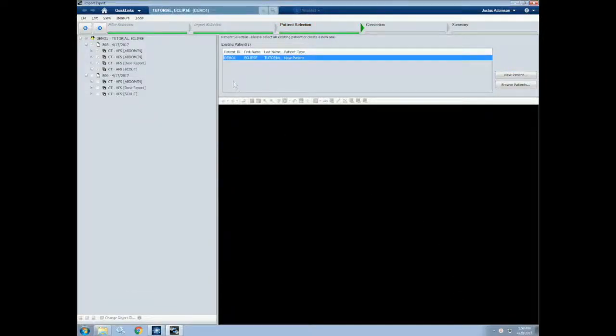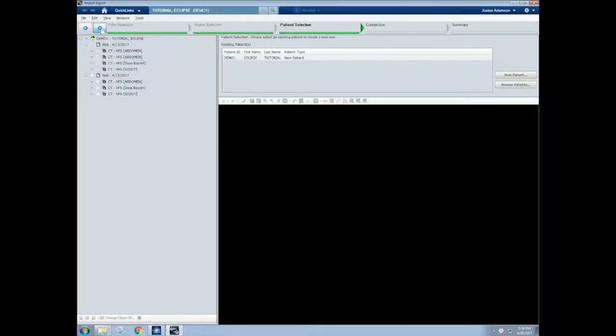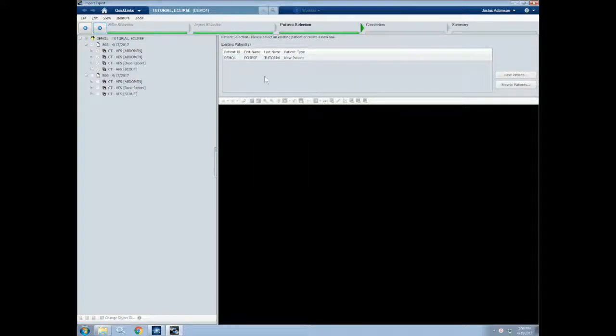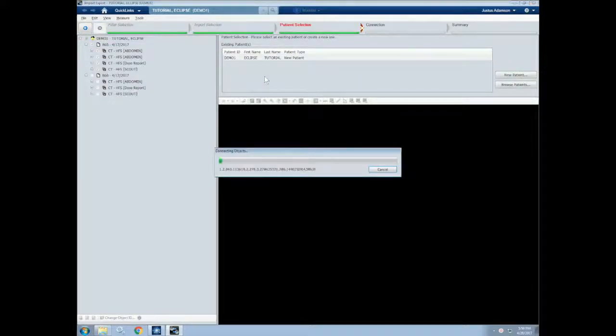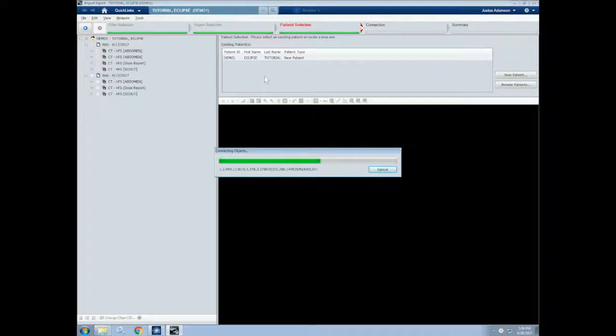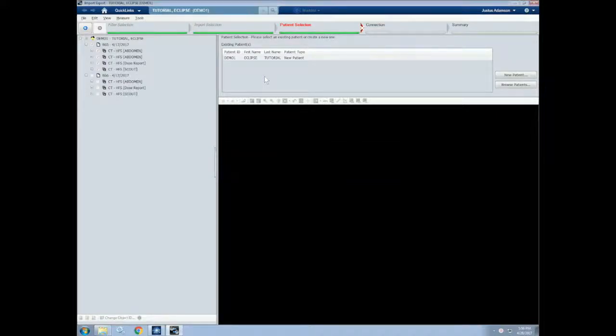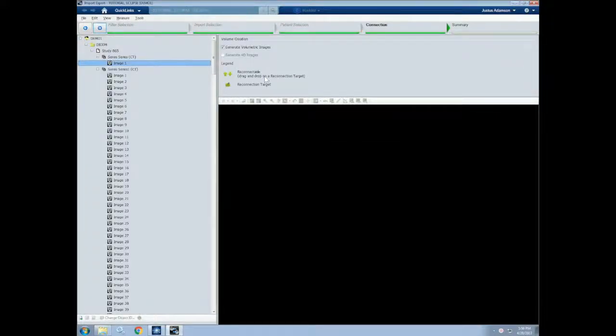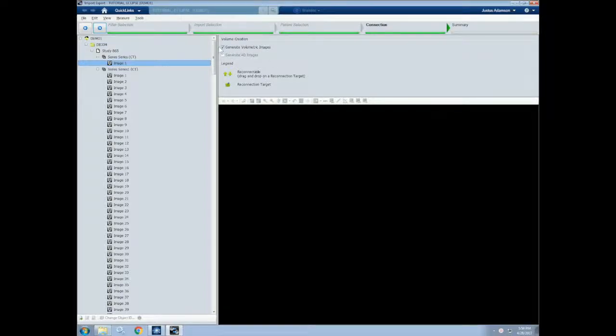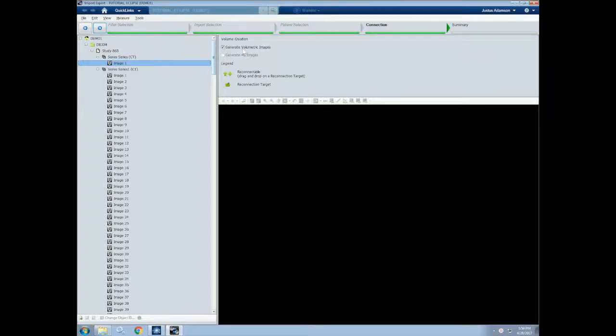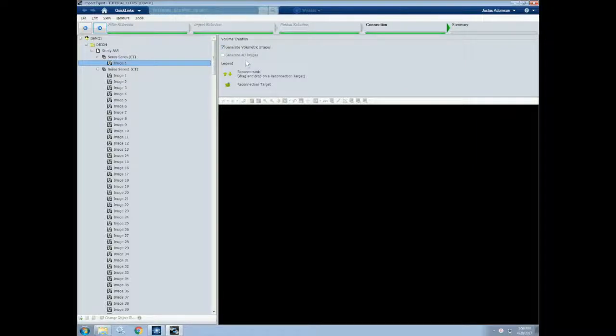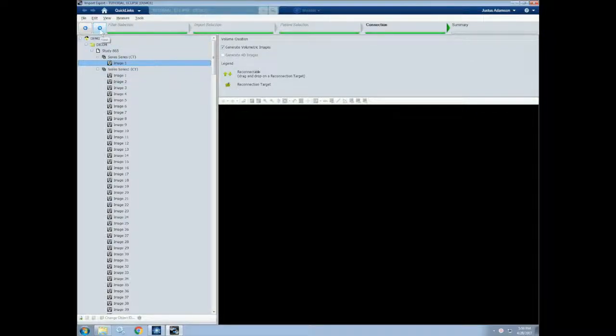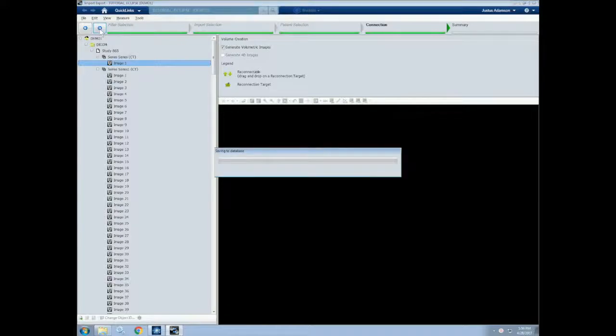Now that we have created our new patient, we can click Next. We now connect the images that we loaded into the new patient that we created. We can leave Generate Volumetric Images because this will put all of the slices together and create a 3D volume. If you had a 4D CT, we can select the Generate 4D Images option, but we do not. Click Next.